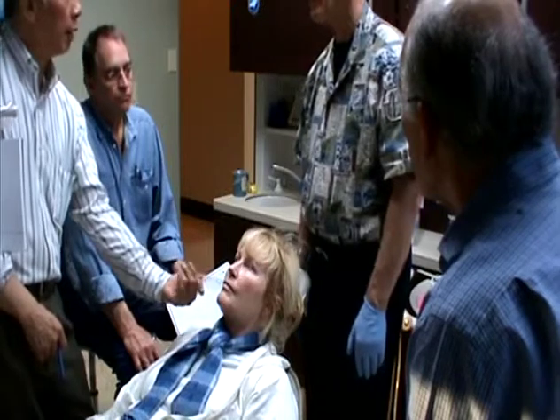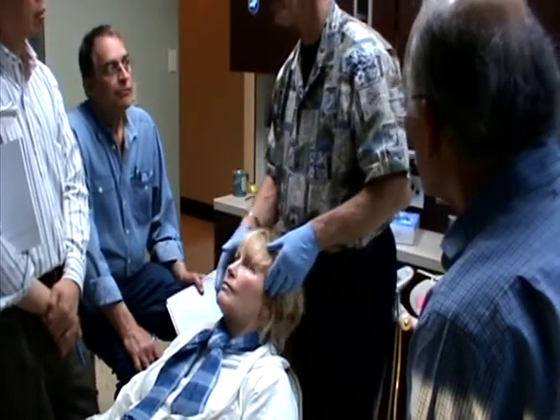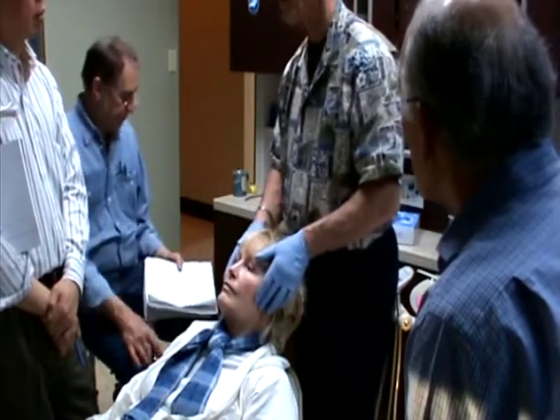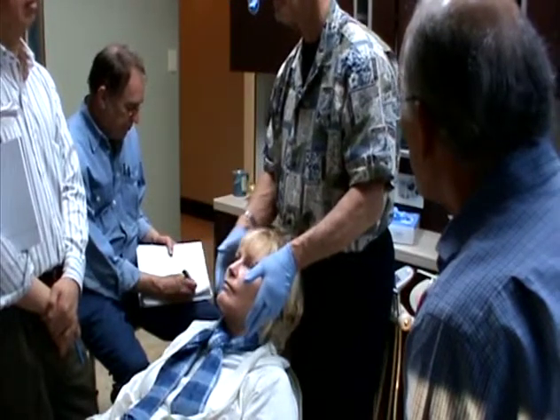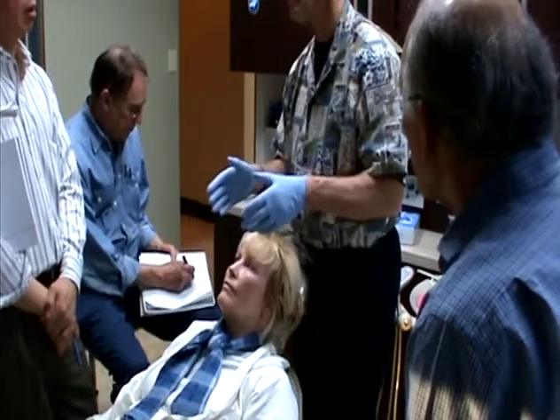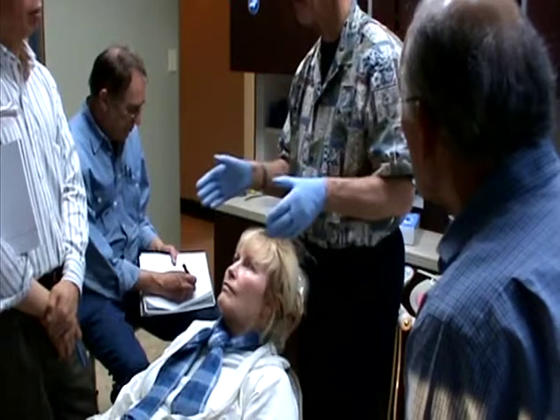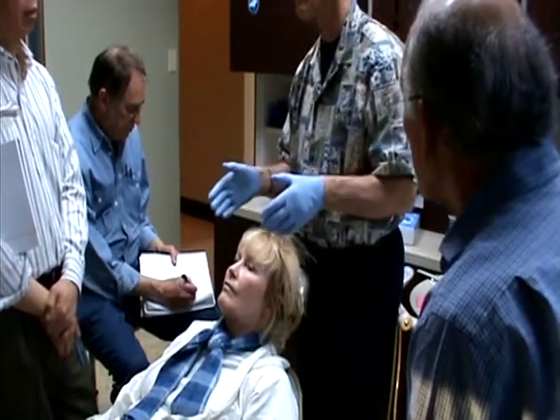So you're saying that if you do that, you won't overexpand, you won't pull this side out so much, and you'll allow this side to go out. Once this side gets out, put a wire to hold that out, and now you can expand the lower equally. It's all in where the pressure goes. You've got to know there's equal and opposite pressure going somewhere.